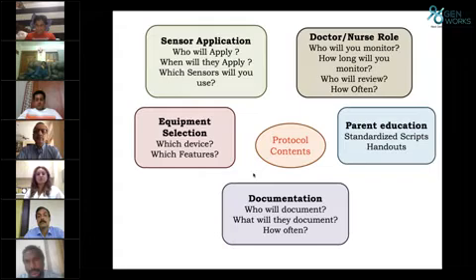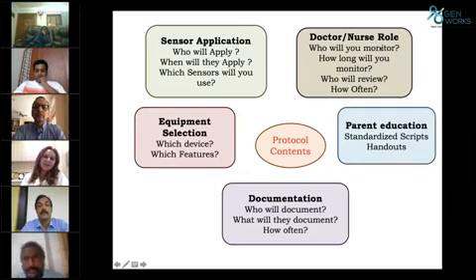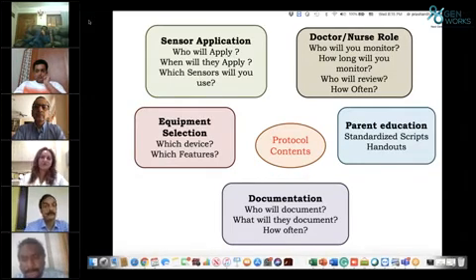And then the other thing you should be looking for is that there should be an algorithm of seizure detection and an algorithm of background classification detection. Plus, there should be a grayscaling availability. So just look at those and then put it in your place.